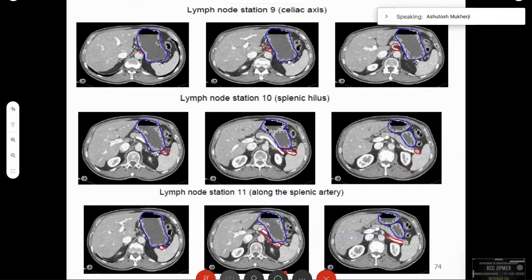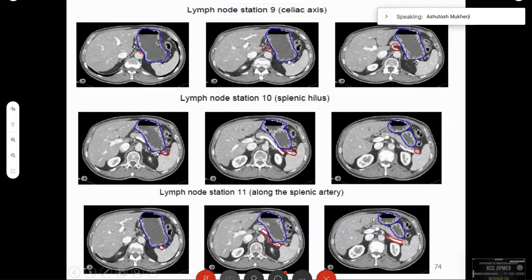In this particular case we are giving extra margin on the left side for the paracardiac nodes because the stomach is lateralized more to the left and the nodal burden is slightly higher. Generally, when planning for the pancreas, nodal contouring would probably be equal on both sides — it just depends on which side has the higher nodal burden. Then the splenic hilar nodes along the splenic artery, and the hepatoduodenal nodes.